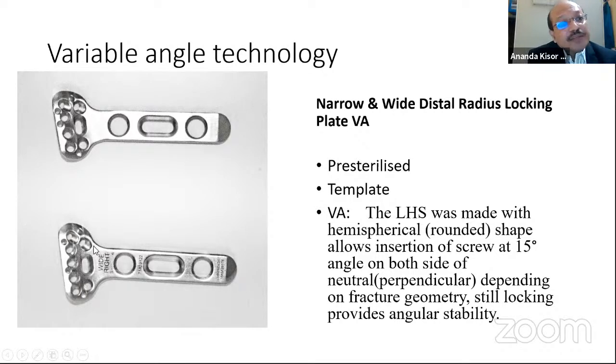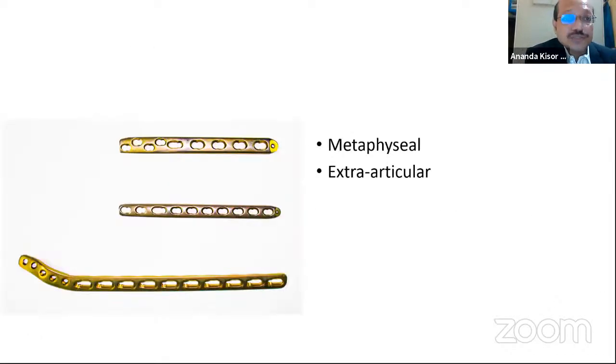Still, there is locking after full insertion. So there is some freedom of placement of the screw, and at the same time there is locking. So we are obtaining both advantages. This is known as the variable angle technology.